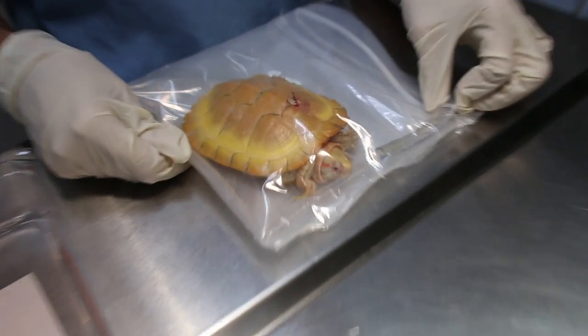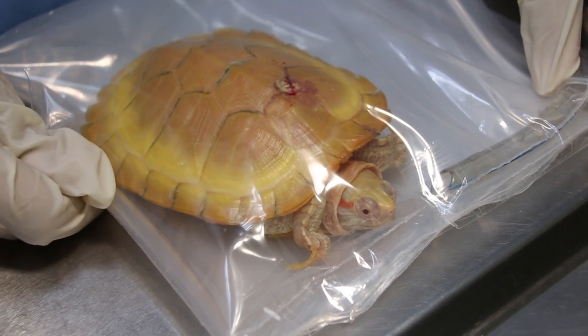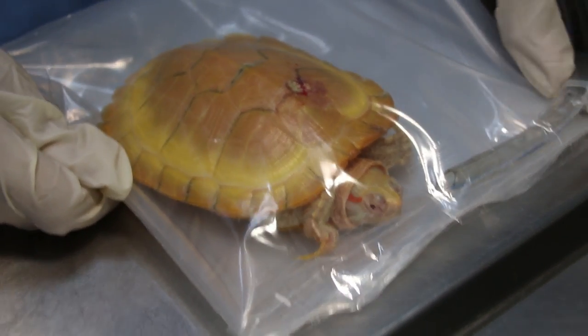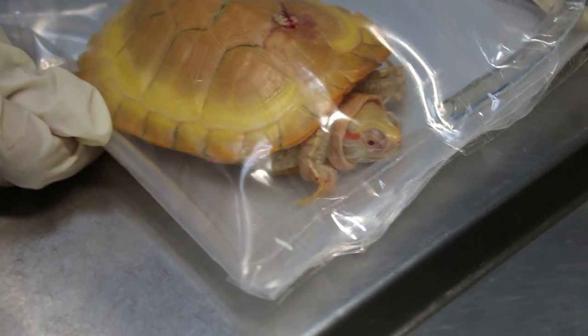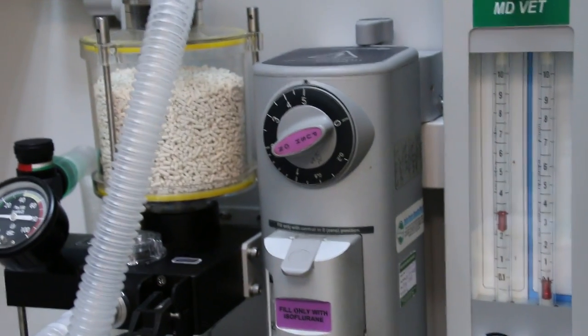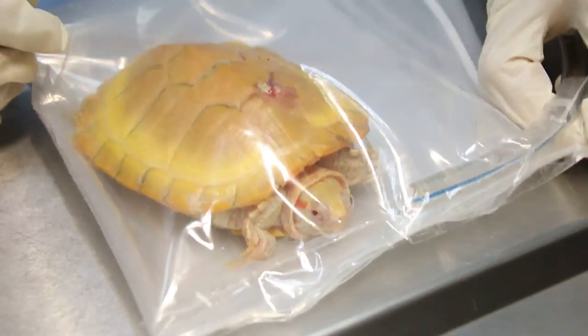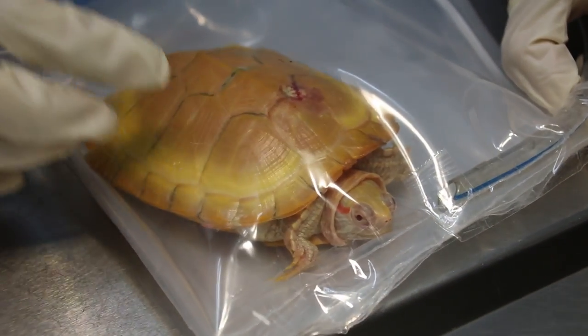As the wounds are very big and quite deep into the body tissue, it's best to give some gas at 5% — this is open a closed circuit — and let him breathe. And then after that, once it's a bit down, then we will do the wash.